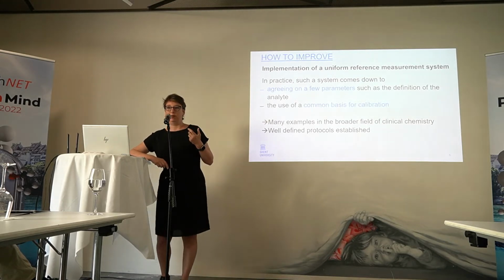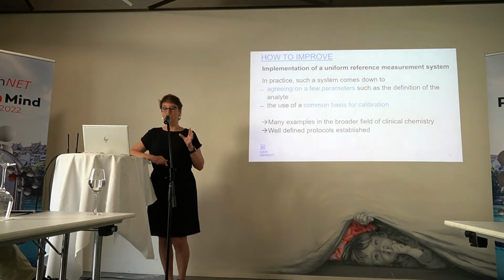And as I already said, there are many examples in the broader field of clinical chemistry. If you would, for example, look at the activities of the IFCC or the JCTLM, the Joint Committee on Traceability in Laboratory Medicine, which is a mouthful, you will see that this concept has been applied successfully for many parameters.